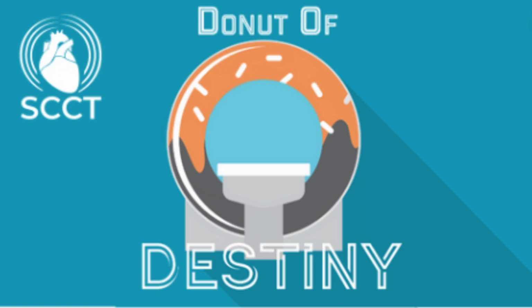So you need absolute time delays because systole is relatively fixed in terms of milliseconds rather than percent. It will take about 250 milliseconds every time. So if you use absolute time delays, the anatomy captured in different heartbeats will line up even better. So that's the paper that touches on that.